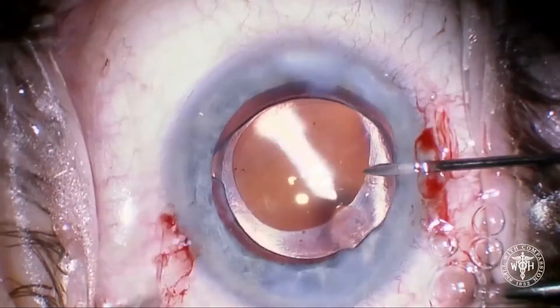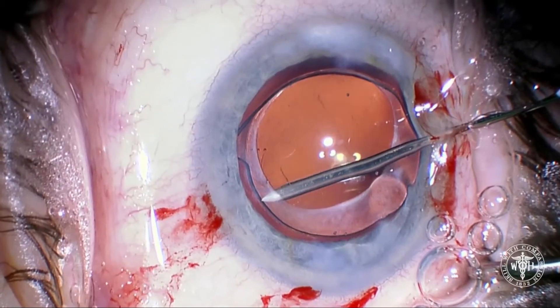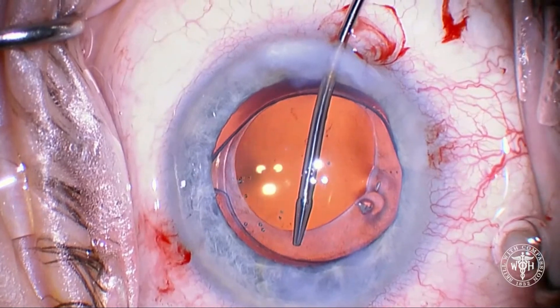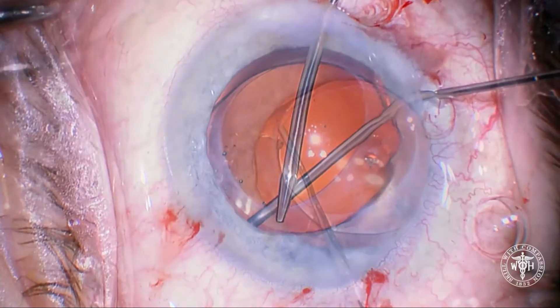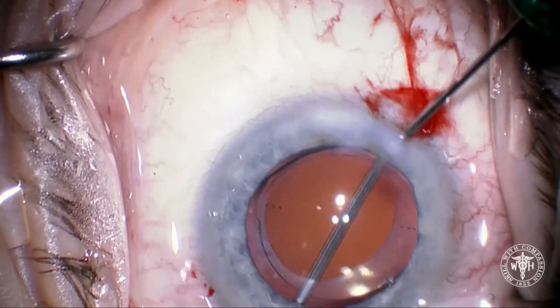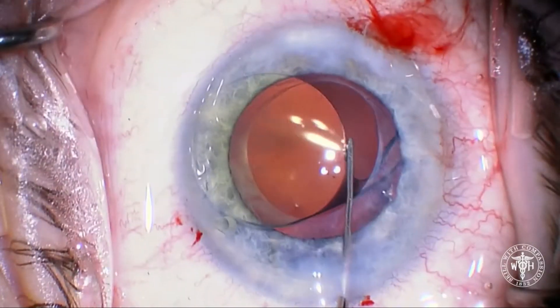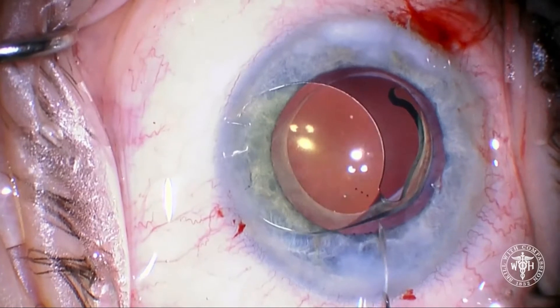We're exchanging a toric for a spherical — not placing another toric. But you've got to get that anterior capsule to lift up. I'm using a fairly cohesive OVD underneath the dispersive to lift up that capsular bag. I tried an upside-down 25-gauge needle — didn't work real well, so I'm going in with an atraumatic micro forcep, using it like a shoehorn. I hold the anterior capsule and go beneath it with a viscoelastic cannula to open up the capsular bag. You'll see the anterior and posterior leaflets begin to separate. You need to visco-dissect all the way back to the terminal bulbs on this IOL platform. The move here is to lift — you want to lift the implant up out of the capsular bag.